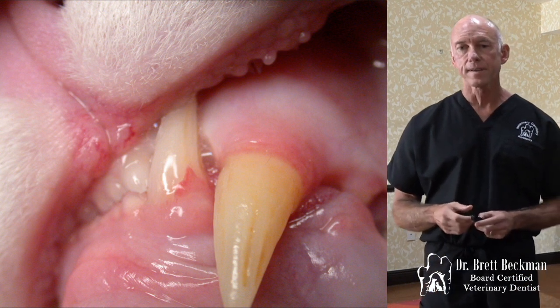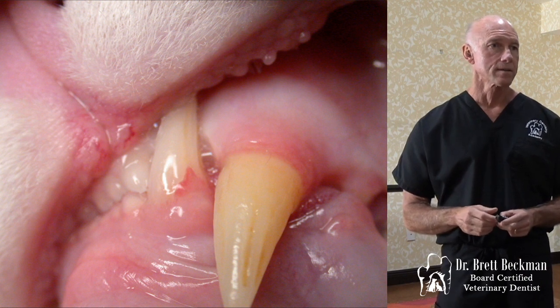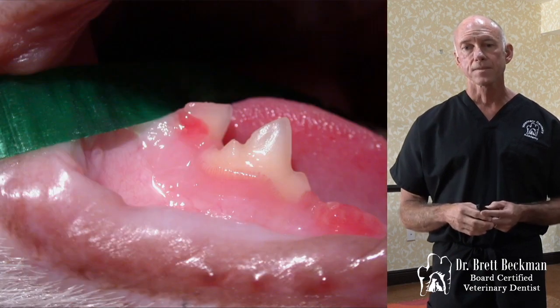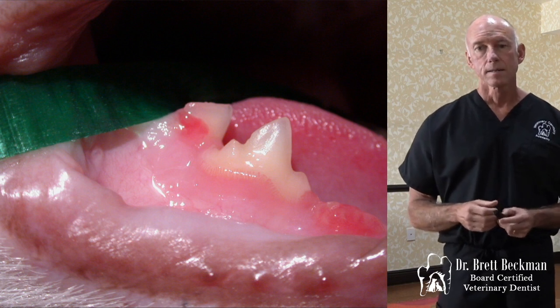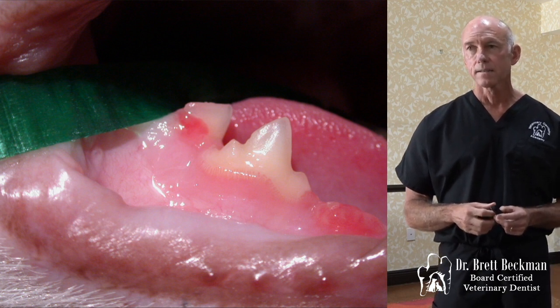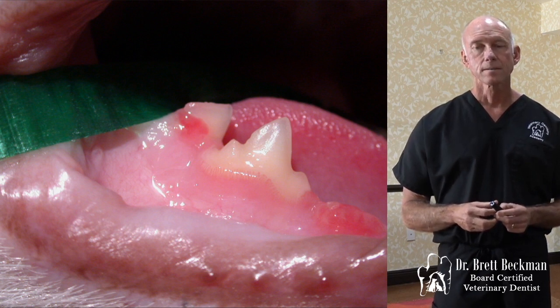It starts off in the root generally, and then it extends into the crown. It may start at the crown-root interface and go both ways. This is a mandibular first molar on the right side, and you can see that lesion there in the mesial crown. The green, anybody know what that is? The green thing that's in that picture?